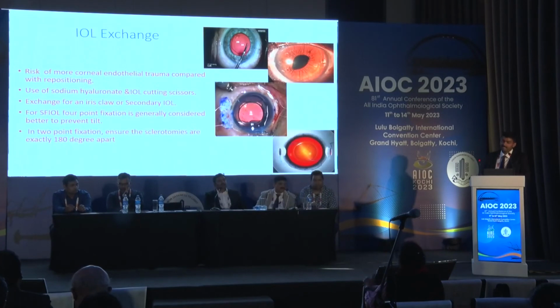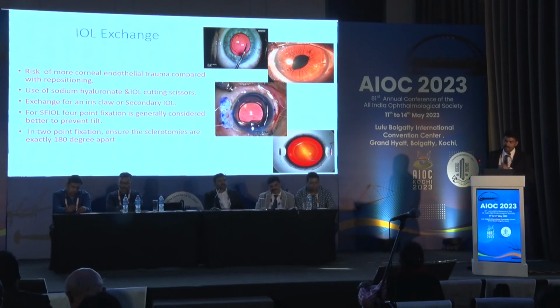So IOL exchange, yes, is most commonly required when you've been overconfident or over enthusiastic about not changing the IOL on the table even after detecting a haptic cut. In such patients, you always have to keep in mind a lot of other surgical nuances.